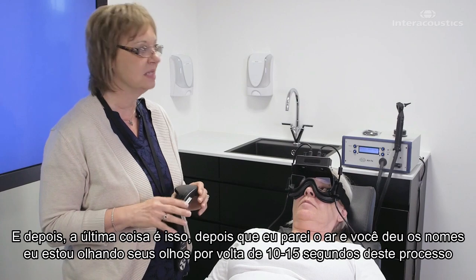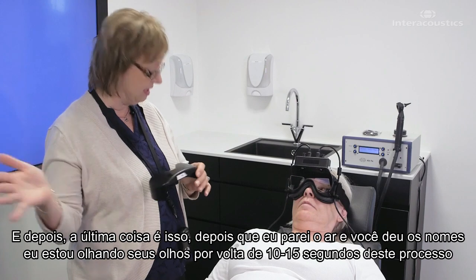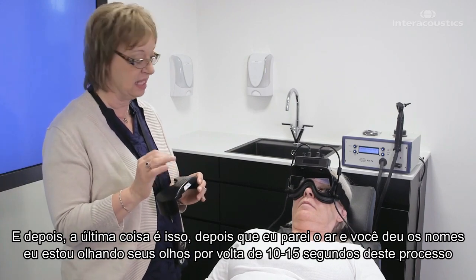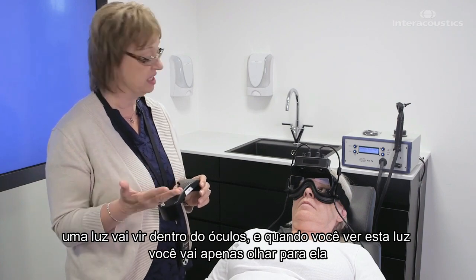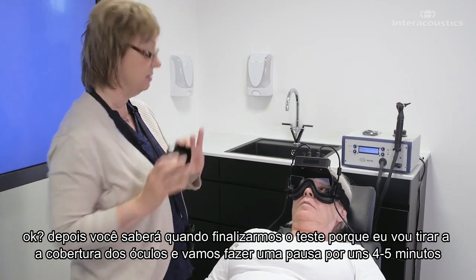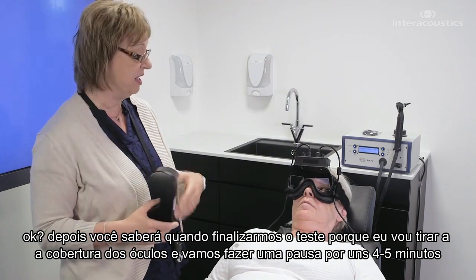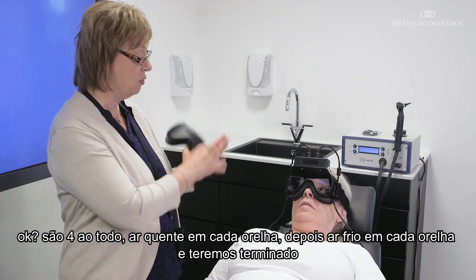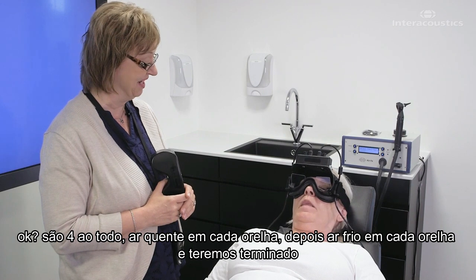One last thing: after I've stopped the air and you're doing your naming and I'm looking at your eyes, about 10 or 15 seconds into that process, a light is going to come on inside of the goggle. When you see that light come on, just look at it. You'll know when we're done with the test because I'm going to take the cover back off. Then we're going to take a break for four or five minutes and proceed to do the second out of the four. So four all together — warm air each ear, then cool air each ear, and then we'll be done.